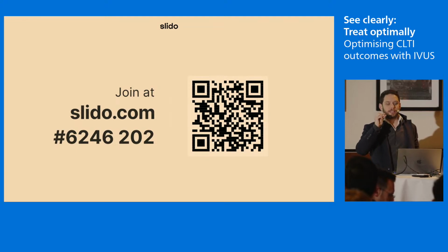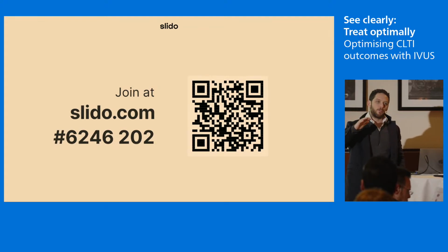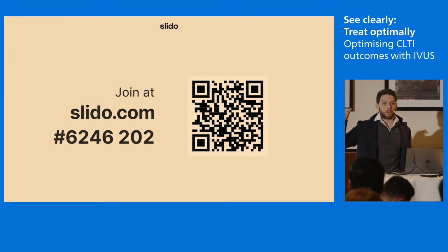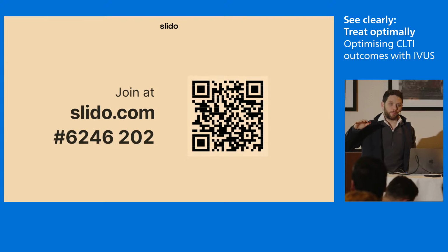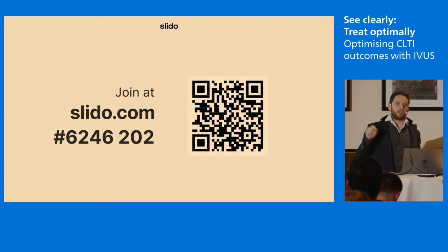And the problem is the room's bright, you're tired after a 3-hour case or 2-hour case, and really sometimes turning the lights off, moving away from the angio room into the side room and looking at it on the IVUS monitor with the lights off, you start, a bit like ultrasound, a bit like x-ray, you see more when you change your field of view. And actually, I think perhaps in retrospect, there was not as good luminal gain as we wanted. I don't know if that's the reason why it went down.